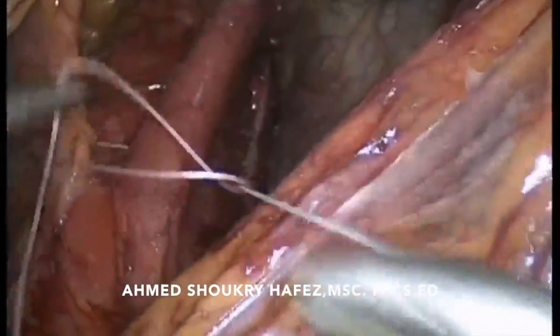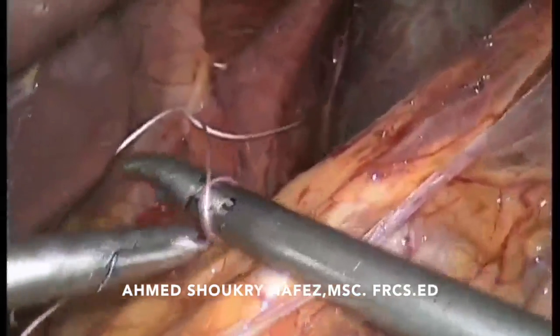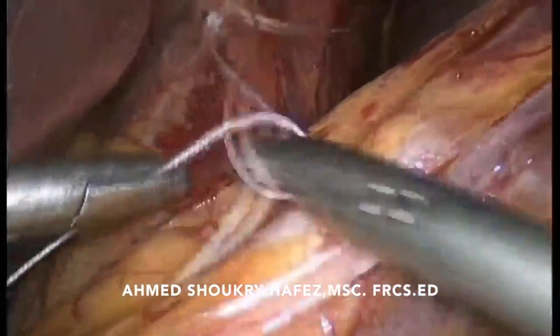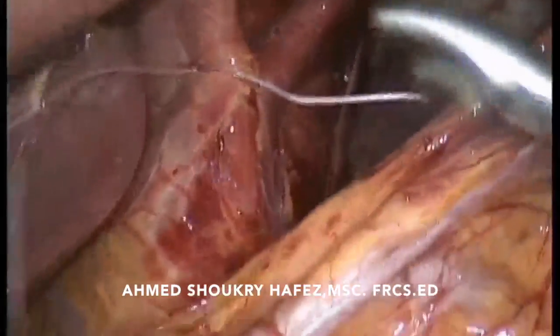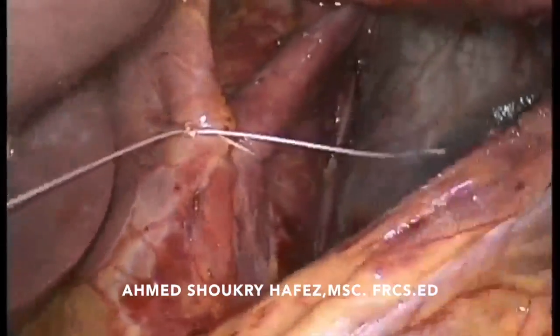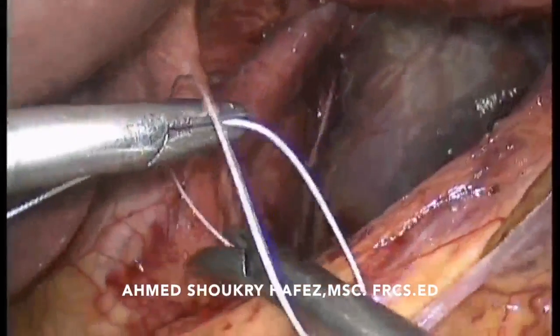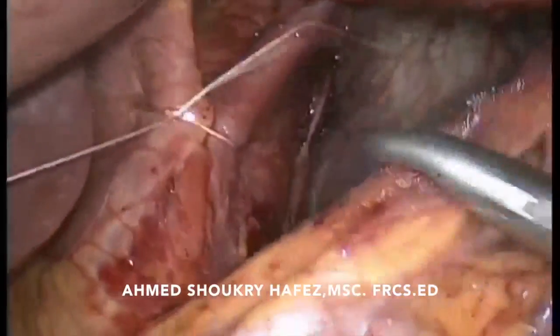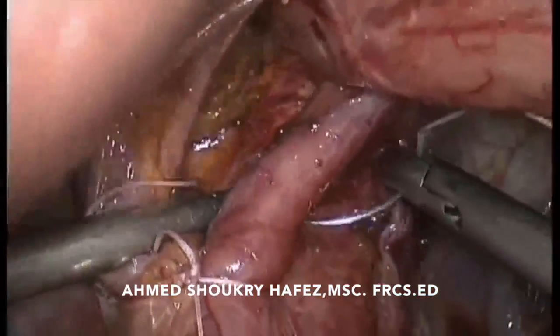As in the video of the Nissen fundoplication, we always use this technique in order to ensure a very tight approximation of both crura so the knot doesn't come loose. This is our preferred technique, and we use it always in the crura repair.